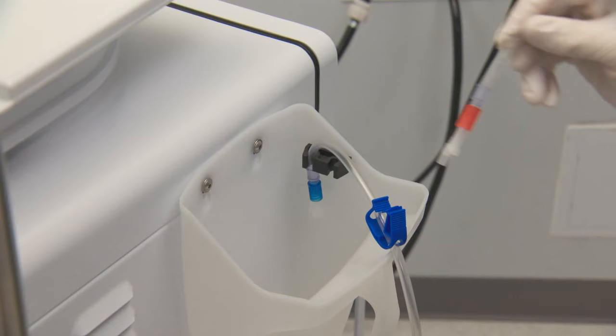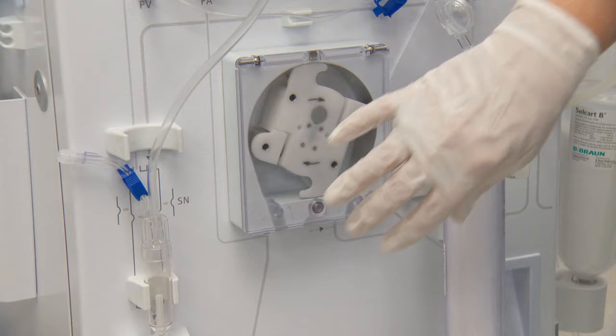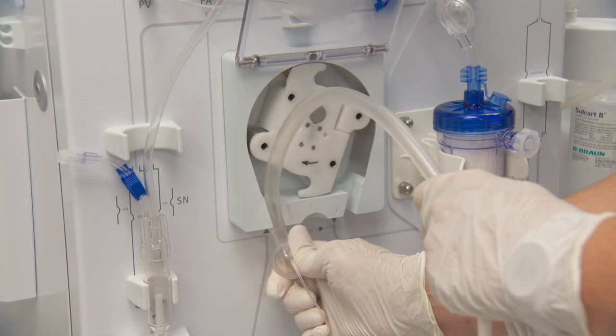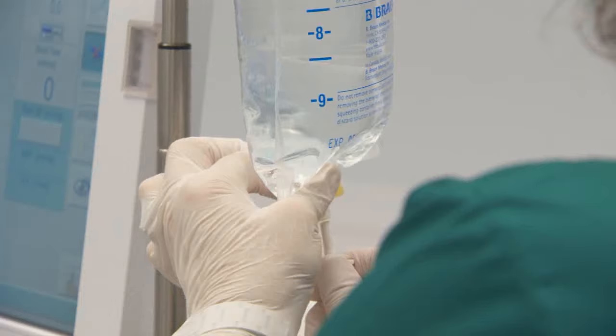Begin by placing the patient end of the arterial bloodline into the rinse bucket and clamp the large red clamp. Partially insert the blood pump segment into the blood pump housing, being careful not to occlude. Clamp the upper clamp on the infusion line and spike the saline.